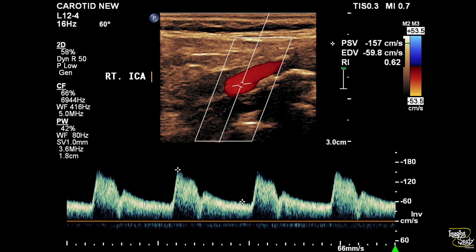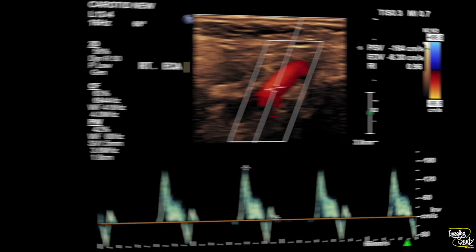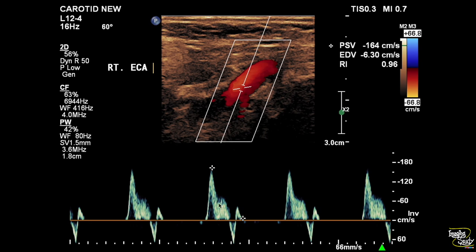This is the right internal carotid artery. The velocity is increased and you can see an echogenic plaque at the proximal part. Here's the right external carotid artery showing the multiphasic wave pattern.